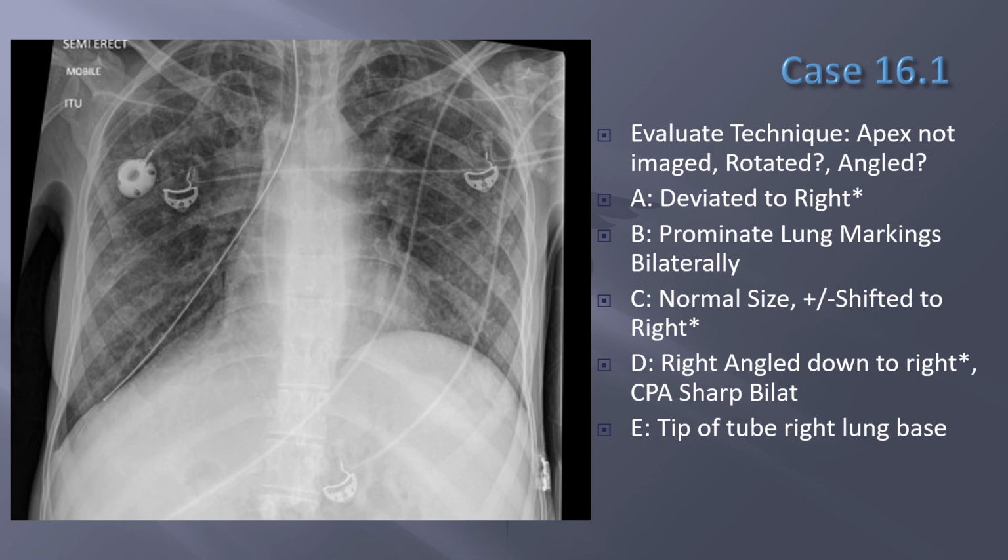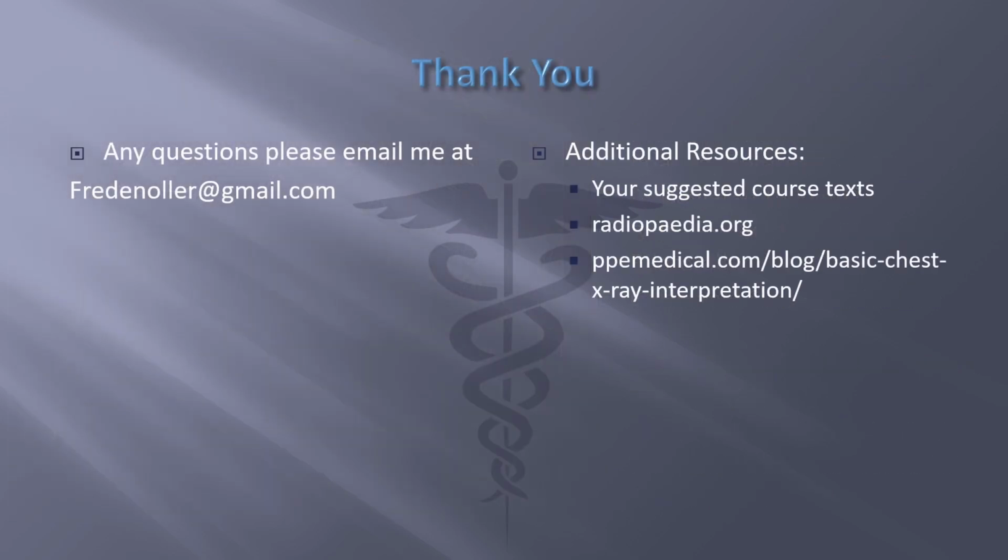And also, when you start hitting resistance, you don't want to push. So if you start hitting the resistance here, you may be in the lungs, and you don't want to keep forcing because you could perforate the lung as well. And also listening over the stomach by pushing air will give you an indication that you're not in the right place, and this just needs to come out. There have been cases where this has been inserted and they haven't checked or done an X-ray, and they started tube feeds and whatnot, and they put tube feeds into the lung. So just be careful. So that's the end.